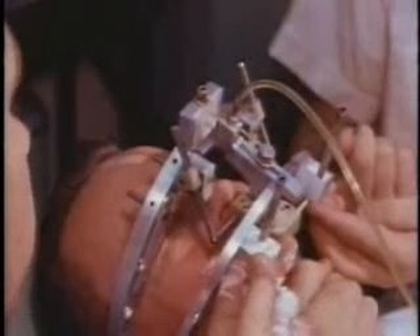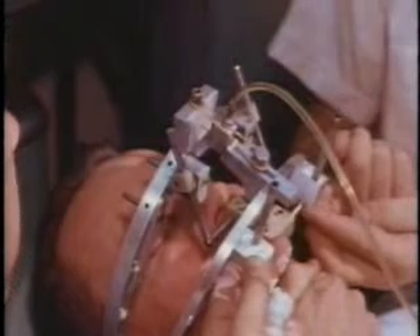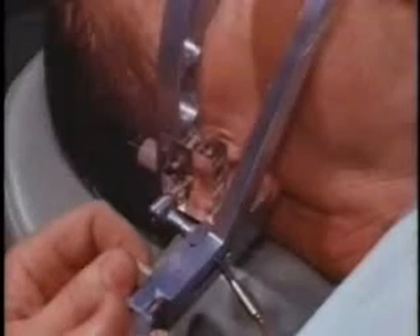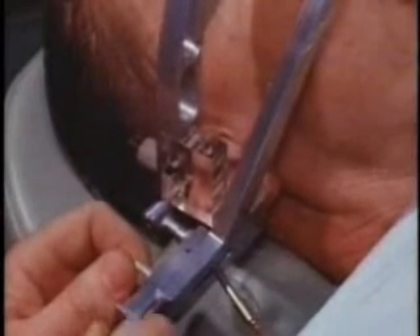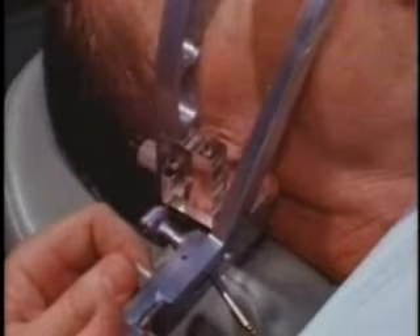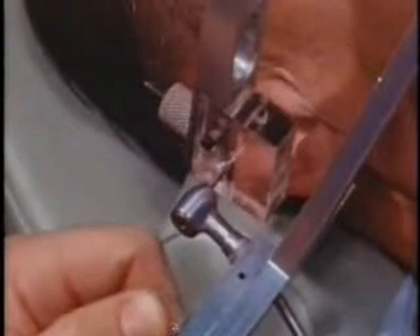The mandible is retruded several times and finally held in centric relation while the plaster sets. The hinge axis of the mandible has now been made collinear to the axis of the recording drills. The drills are retracted from the alignment blocks, thus leaving the lower bow supported totally by the mandible. The mandible is retruded and the drills reinserted to check the accuracy of the axis mounting.